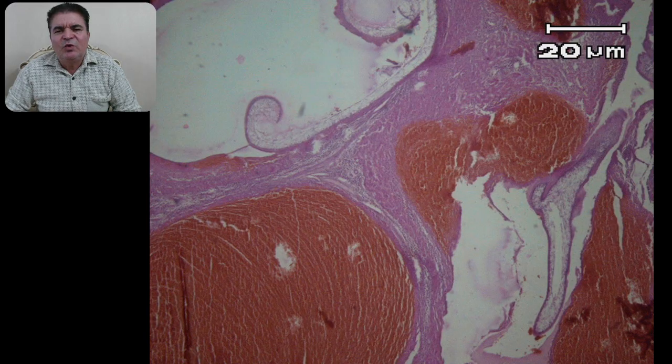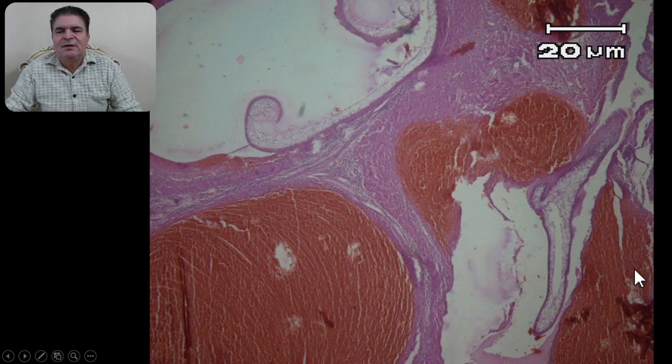When the histopathological slide of the case got ready, as you can observe in this photo, this part of the liver is normal, made of hepatocytes, but there is a migratory tract filled with red blood cells here, this part and this part, and two sections of the parasite larvae are seen here and here.